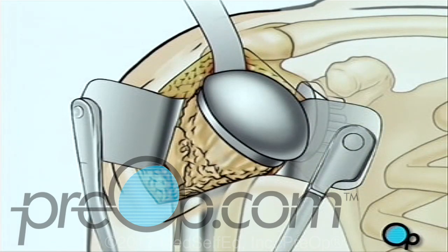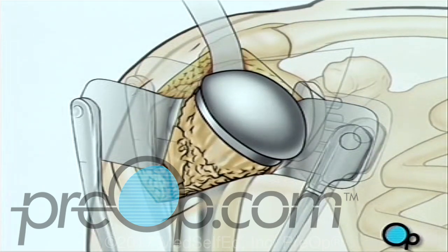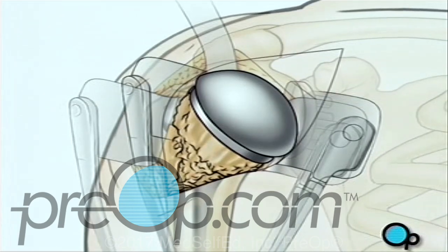The artificial ball joint is turned inward and fit into the socket, and the team carefully checks to make sure it fits and allows the full range of normal motion.